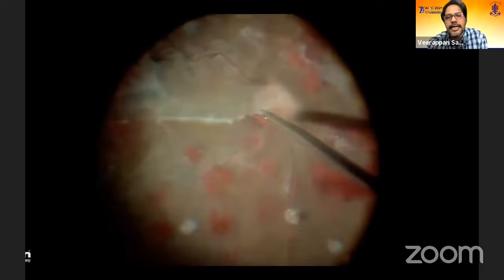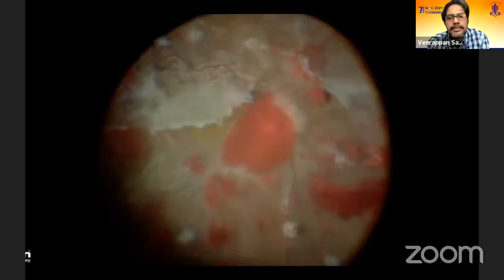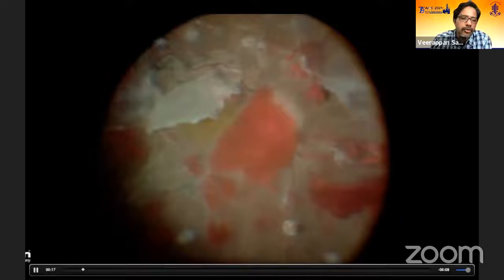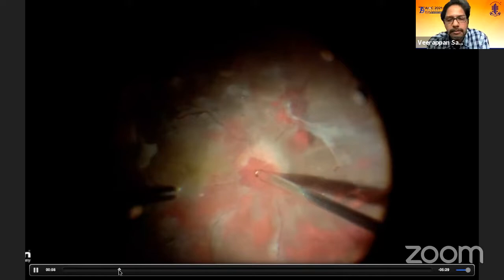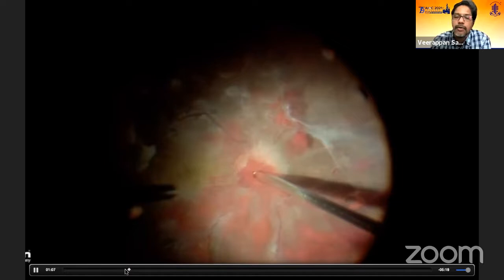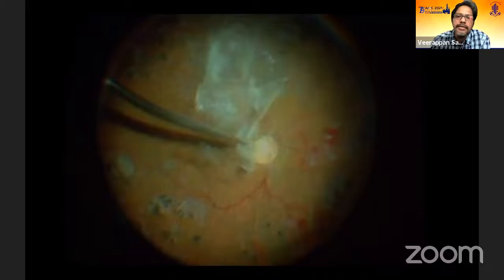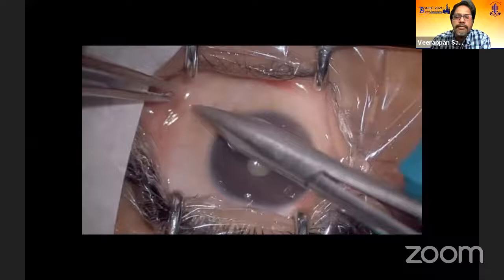When disc bleeding occurs, which can upset especially junior doctors, always make a call on what is bleeding — whether it's a ruptured NVD, a ruptured venule, or a ruptured arteriole. A ruptured arteriole is one of the most drastic conditions and very difficult to control. Usually what bleeds is the ruptured neovascular membrane of the disc, which can be controlled by raising the bottle height. If it does not stop even with maximum bottle height, you can apply gentle pressure with a blunt instrument — a soft-tip cannula or a retinal massager. The viscous dissection technique using viscoat stained with brilliant blue G for macular peeling is an option but not always ideal. Bimanual technique is very helpful to deal with tenacious membranes where the retina is very thin. If you do everything correctly, you'll be able to achieve a happy outcome.